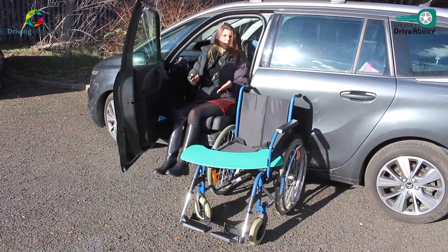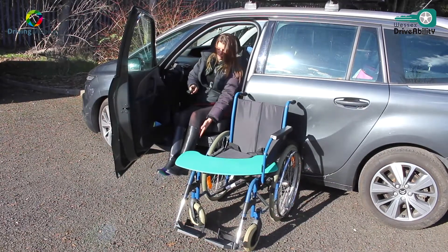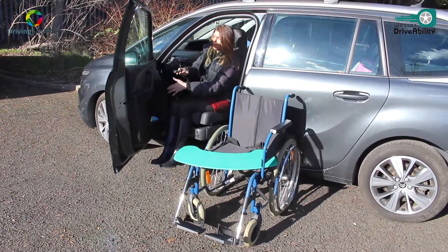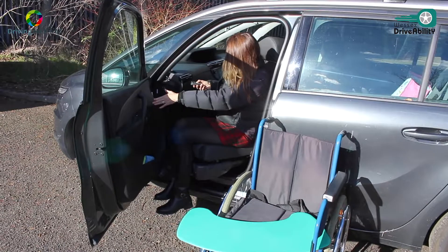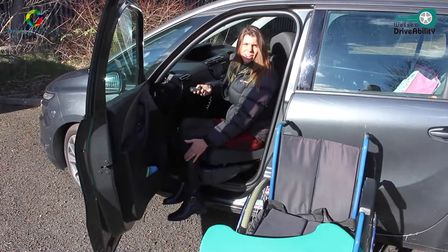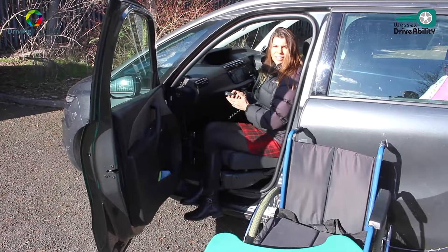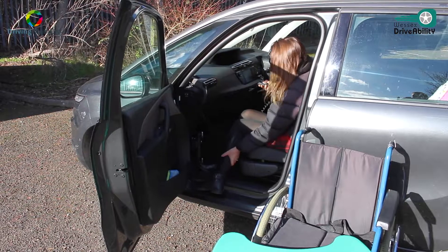This can be done by a person totally independently, or you may have an attendant with you. If so, you may need to be a little bit careful of people's feet, depending on the type of door for the car or house. The extended door, which is sometimes useful — as you can see, the footroom can be a little bit tight — but used in conjunction with extended door hinges, it's a very useful piece of kit. You may need to tuck someone's feet in to help them.